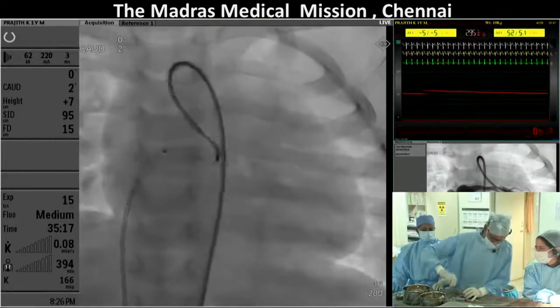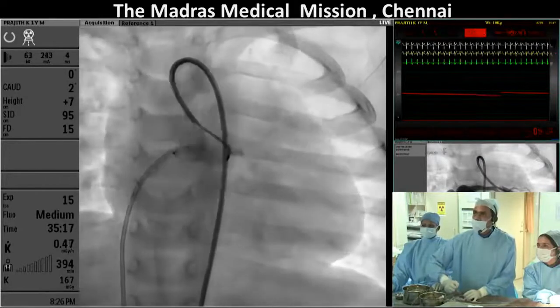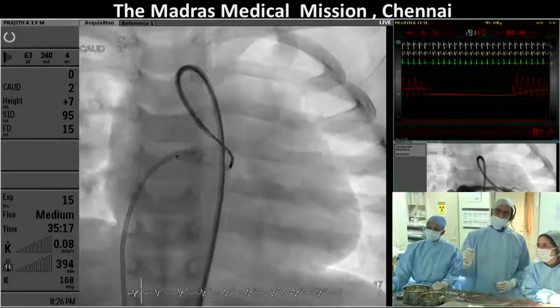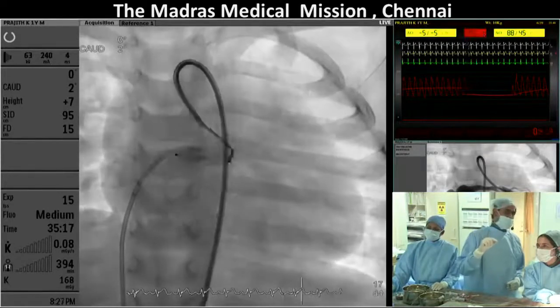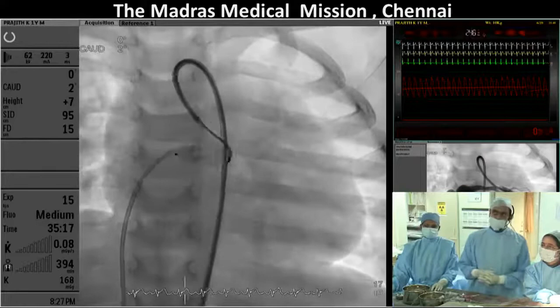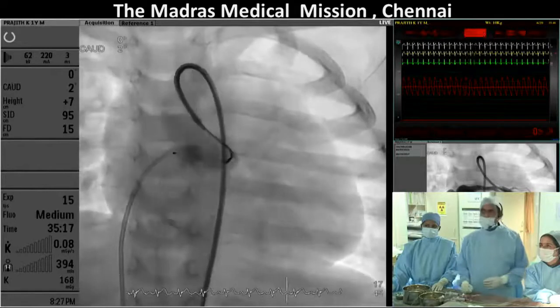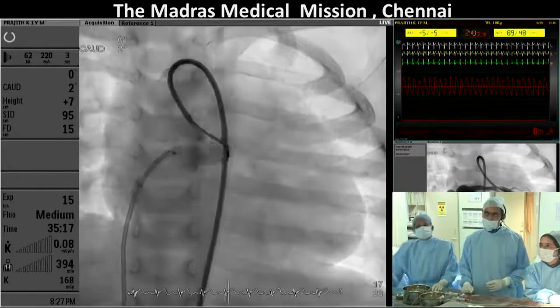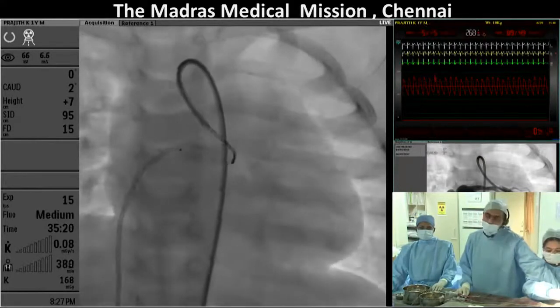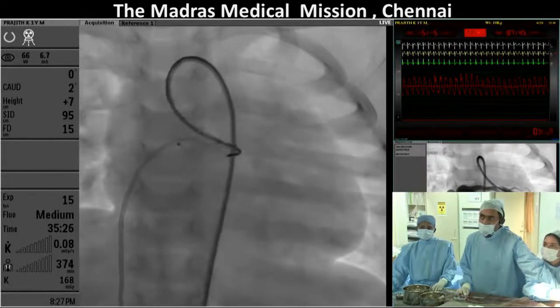Shiva, just as a question, as to why you preferred arterial delivery and not the venous delivery. See, I mentioned to you initially that I was not able to cross the fistula because I came out through the smaller exit orifice on the RA. I was not through the larger exit orifice. No, but you could have sent the same plug which you have sent through the arterial side from the venous side using the same 4 French catheter. Can I make a comment here? Yep.